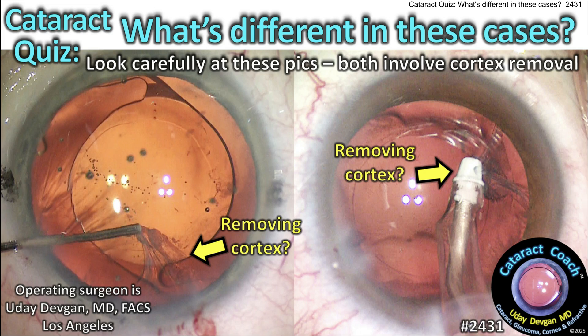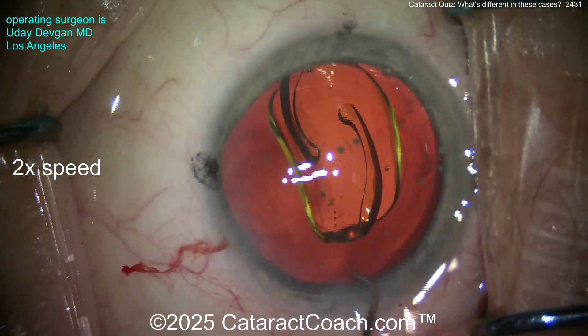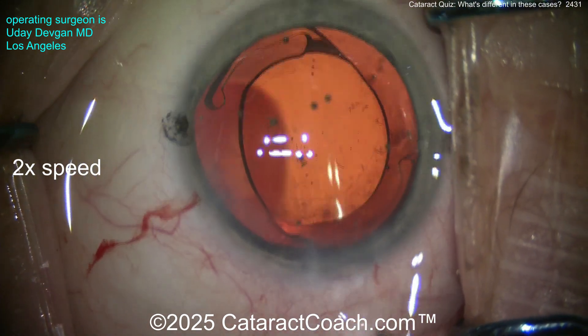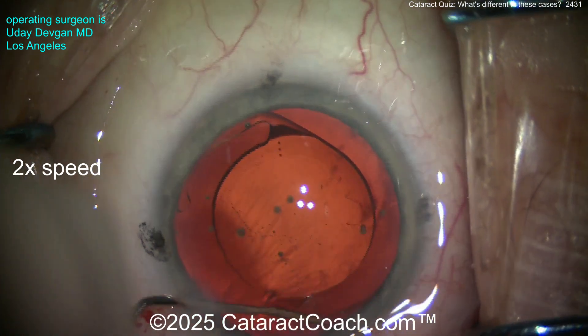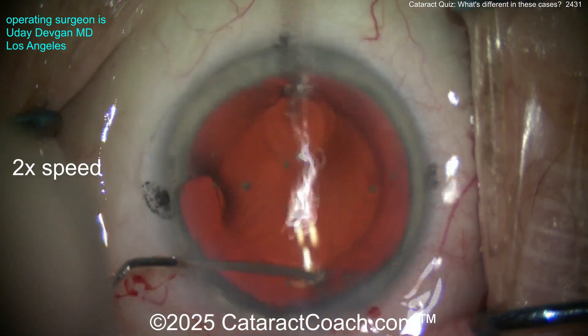CataractCoach.com cataract quiz — what is different in these cases? Look carefully. These pictures both involve cortex removal. Here comes case one. Going in the capsular bag, looks pretty reasonable, looks like a good rexis. There was no zonulopathy, nothing noted. Do you see anything? Look carefully — what do you see? I see some cortex. Did you miss it? Did you get it?